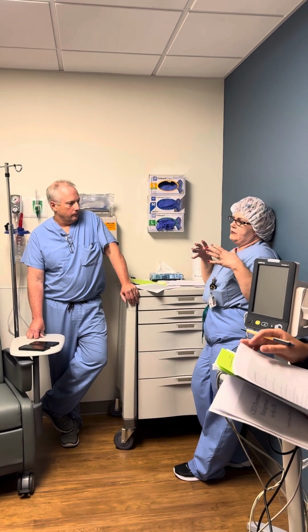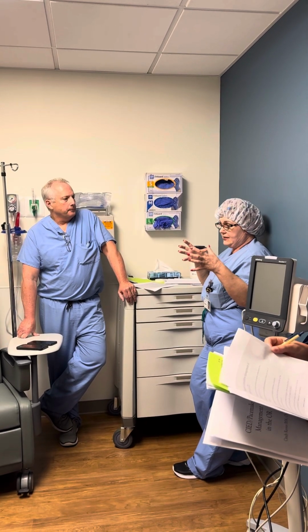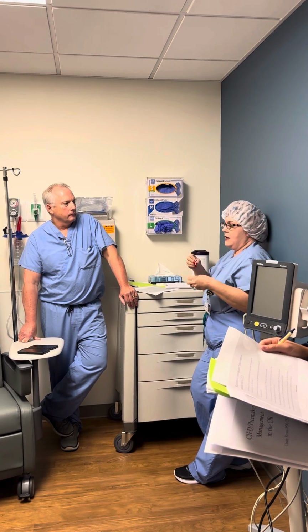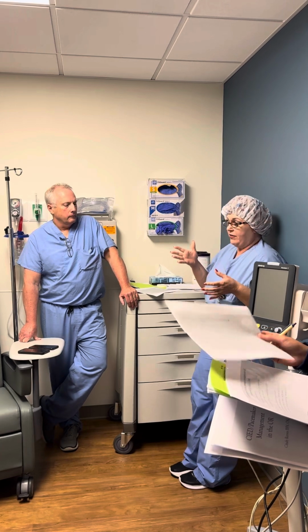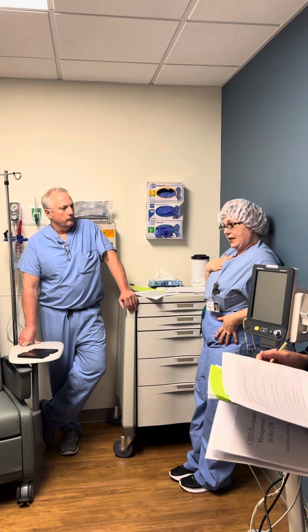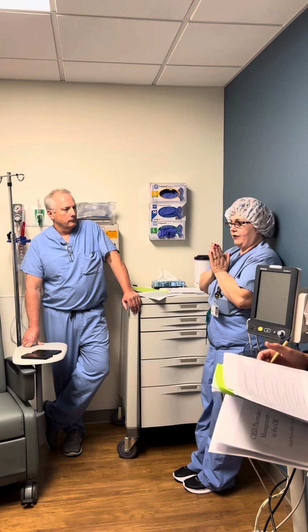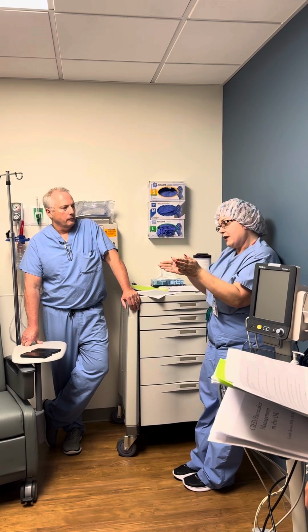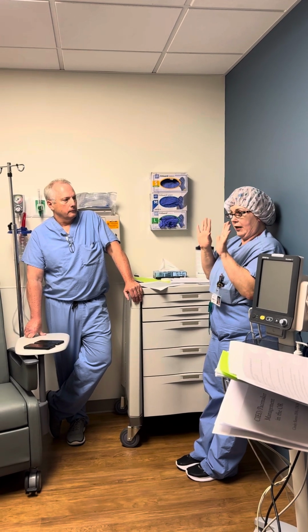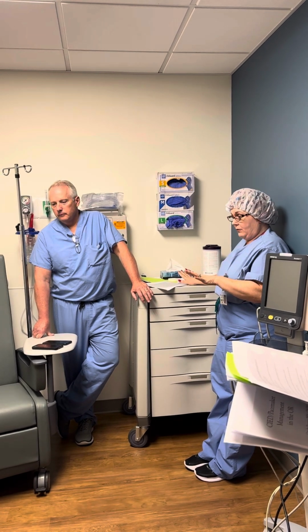Now, what we want to do is make sure we're collaborating with the pre-op nurses and with anesthesia to make sure of how we want to manage the patients. Sometimes they may ask for the defibrillation pads to be brought in the room with patients. That doesn't mean necessarily placed on the patient. When I talked with anesthesia, they said it would be perfectly fine to leave them in the package, but have them in the room and maybe have the crash cart with the defibrillator or AED outside the room, just so it's available.